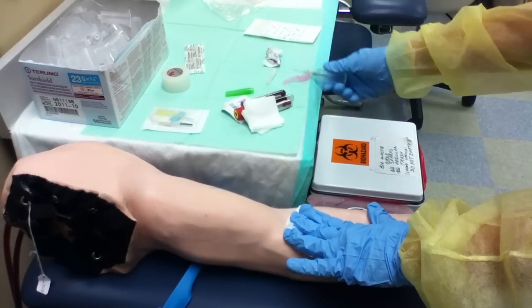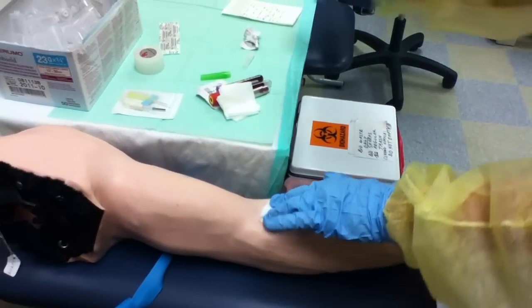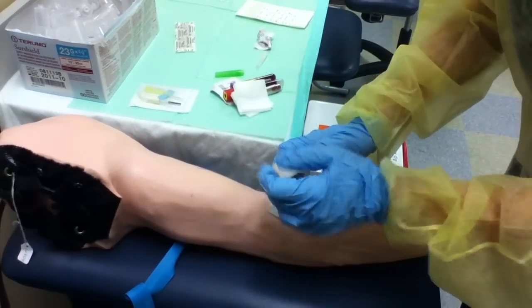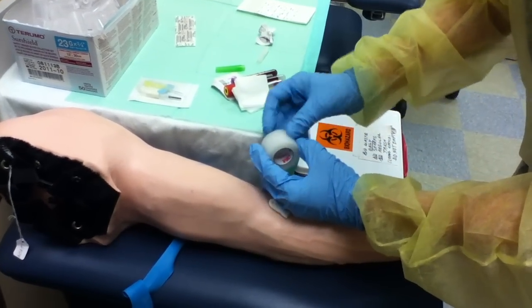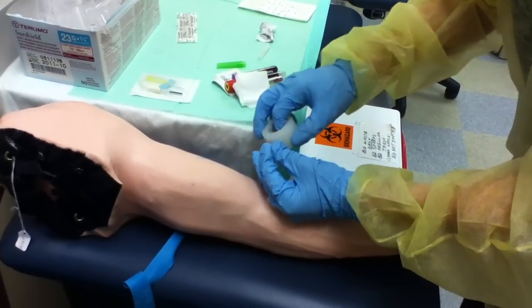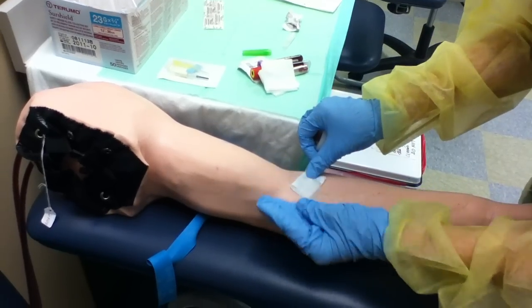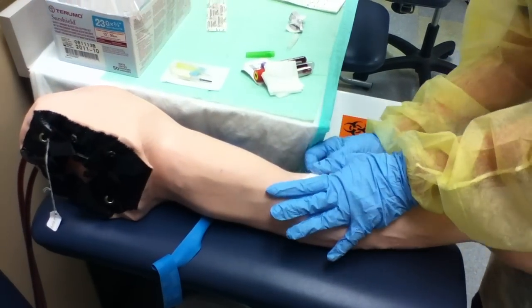You're going to put a two-by-two on the patient's arm. You're going to take your needle guard, put your needle in the plastic, and throw it into the sharps container. You're going to apply a piece of tape. You're going to be talking to the patient and ask, are you okay, do you feel all right? Make sure that the site isn't swollen or bleeding.